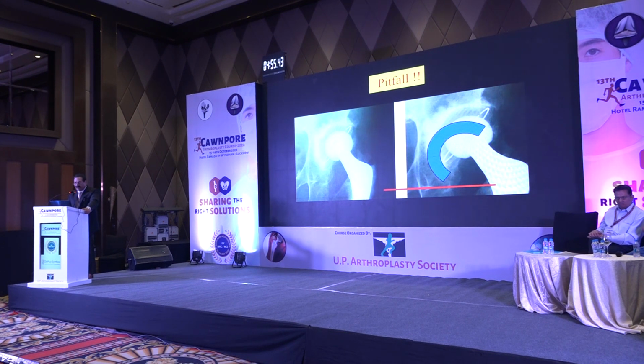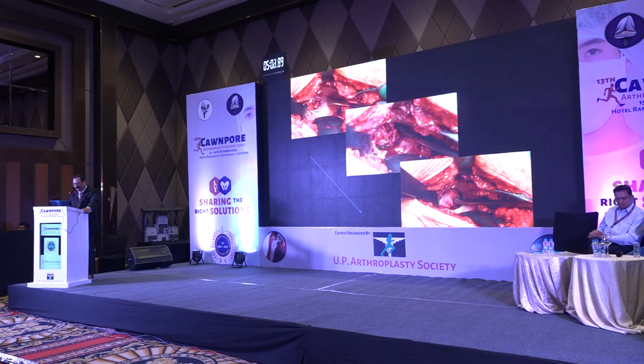It is not acceptable. How do you reach the teardrop? How do you reach the medial wall? You need to remove the osteophytes at the floor. This is about putting the cup medially or superiorly.